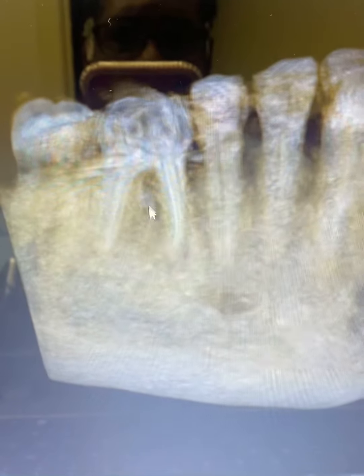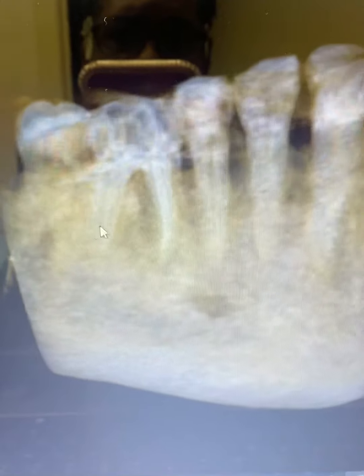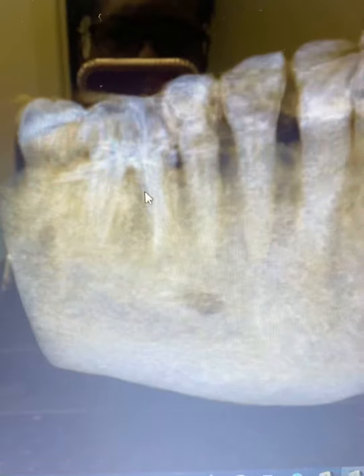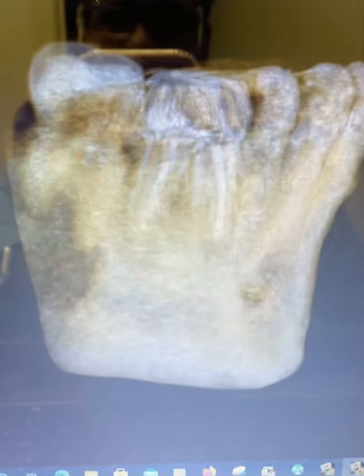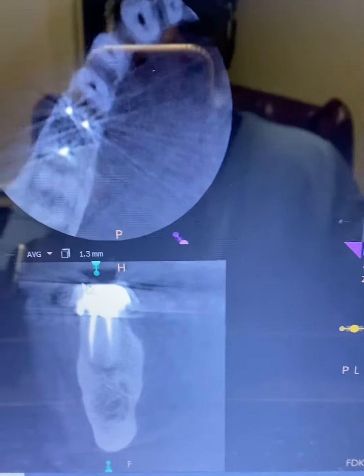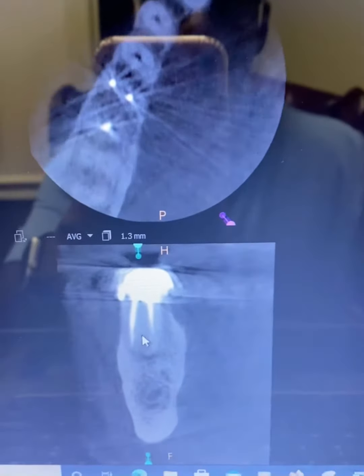We can see tooth number 30 and its previous root canal. As we look at the coronal slice, we can see that the mesial buccal canal stopped really short — about six millimeters short from the apex.